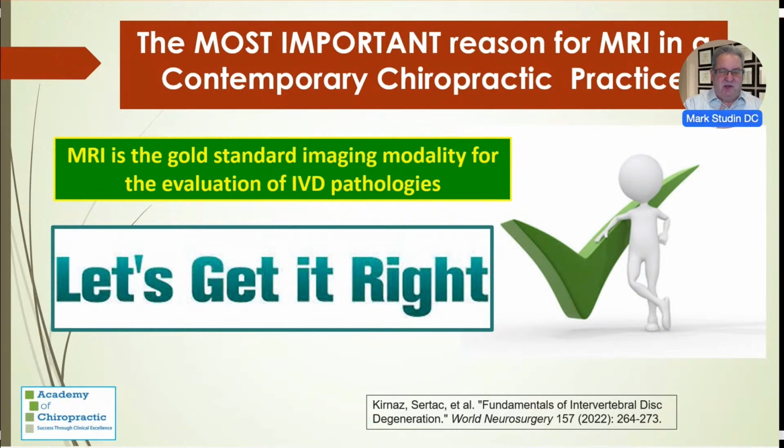I am a spine specialist. I want to know. I don't want to treat blindly. And I tell you, when I was practicing back in the 80s, we didn't have MRI and we guessed. I remember so many patients, I wish I had this tool available so I wouldn't have to guess on my patients. A lot of them got well without it, and a lot of them, frankly, I delayed necessary care or surgery, and I hurt a few, and I'm being honest with you, because this tool was not available to us. It's available to us now.